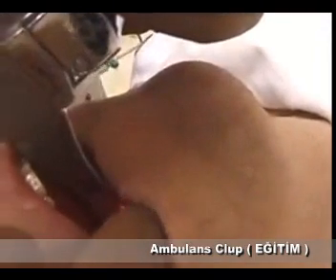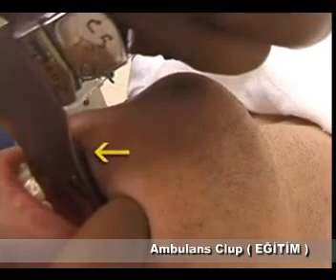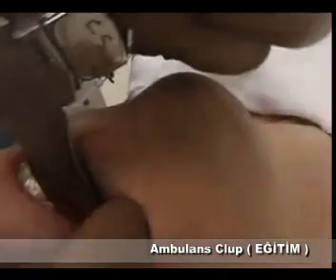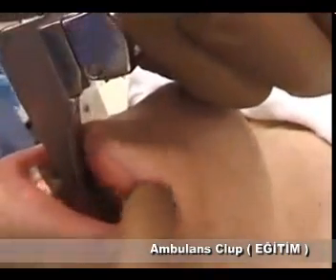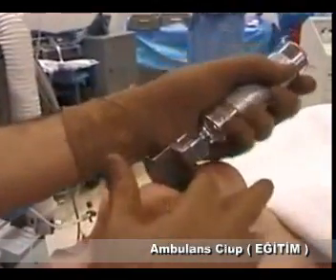Not uncommonly, the lower lip is dragged into the mouth and compressed between the laryngoscope blade and the lower incisors. This can cause deep lip lacerations which may lead to bleeding and airway management complications. To minimize this risk, the laryngoscopist should always investigate if the lips are caught against the teeth by sweeping them with his or her fingers as shown here.